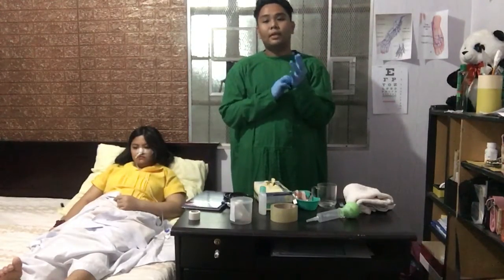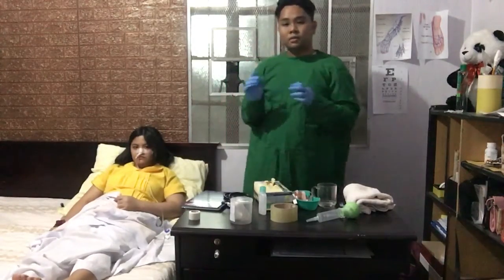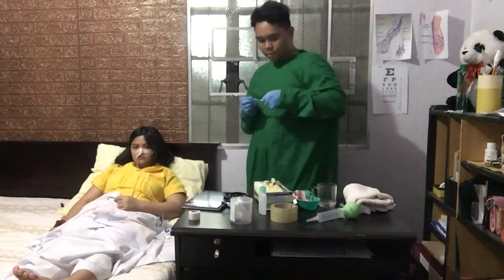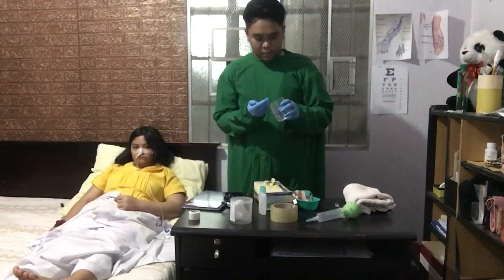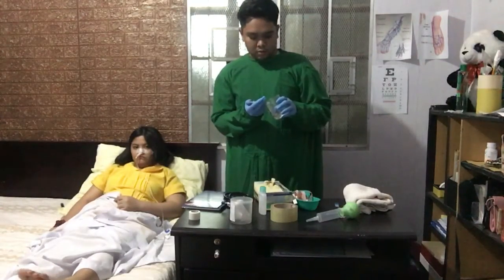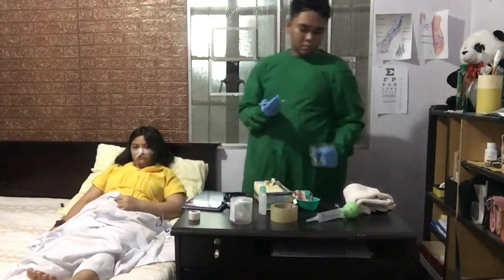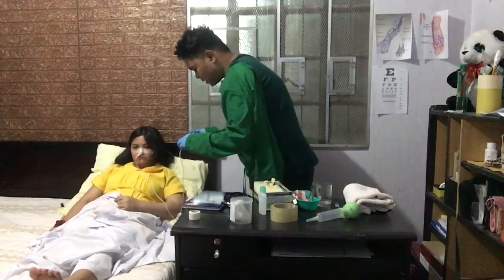Then, next is we flush the tube with 30 ml water per irrigation. Then, we disconnect the syringe from the tubing and cap the tubing while preparing the formula feeding equipment. We flush using the irrigation water. Aspirate tayo ng 30 ml. Then, insert it. Flush it.